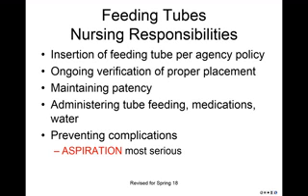And lastly, nurses must prevent complications, most especially pulmonary aspiration, which is the most serious and common problem associated with tube feeding. Prevention of aspiration is the nurse's #1 priority when it comes to tube feeding.